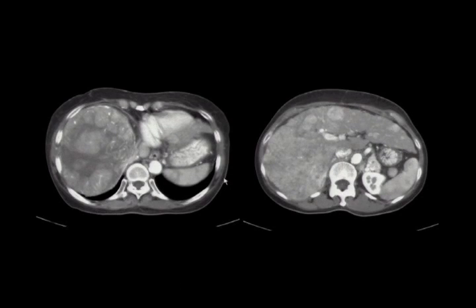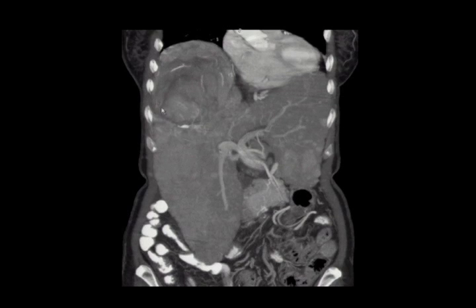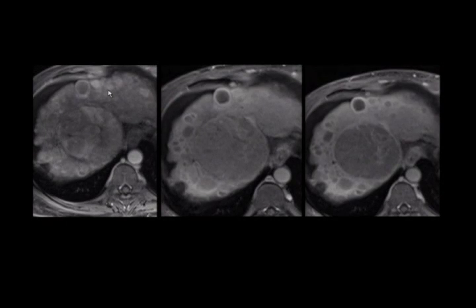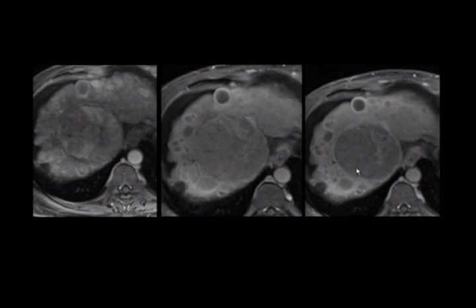Additional CT images show another patient with a huge tumor at the dome of the liver with additional areas of arterial enhancement throughout—really diagnostic of multifocal HCC, with a dominant tumor at the dome and additional smaller nodules throughout. On MRI, the same principle applies: arterial phase, portal venous phase, and an additional equilibrium phase acquired two to three minutes after contrast injection. We're looking for brightness on the arterial phase with washout over time—multifocal HCC with some fairly significant dominant nodules more centrally.